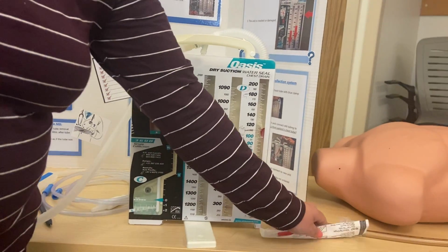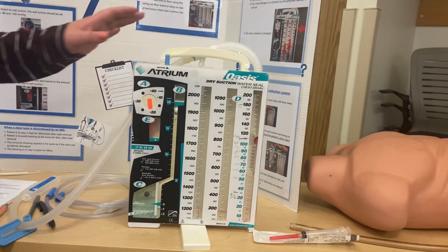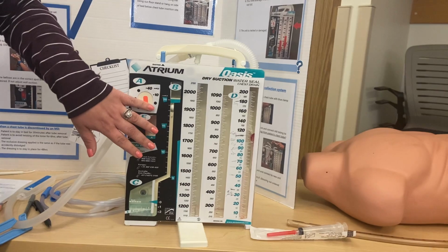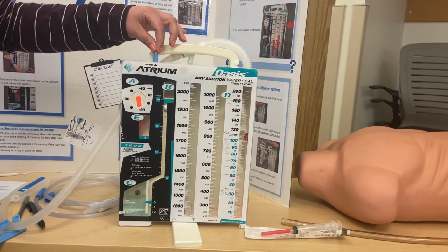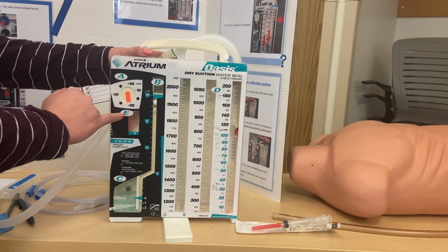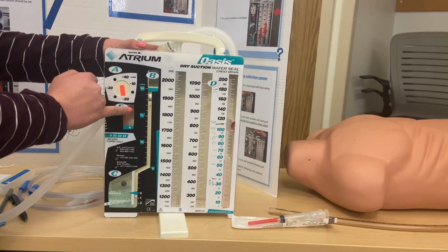If the order says patient chest tube to water seal, all that means is you're still going to keep the suction at whatever the default is, unless they say otherwise, but you're just not going to hook it to wall suction. And if you keep it to water seal, this little window here with the E next to it will just be a clear window.